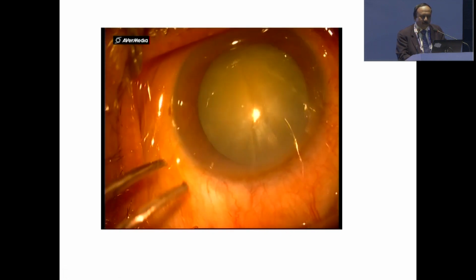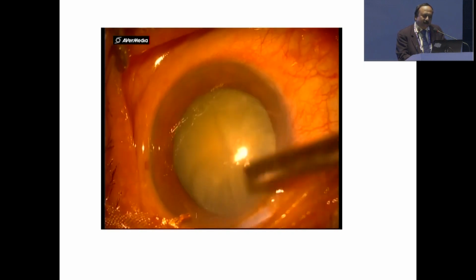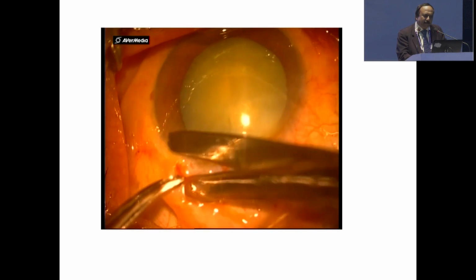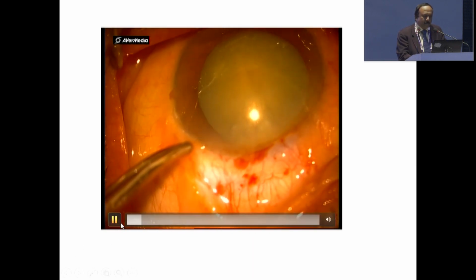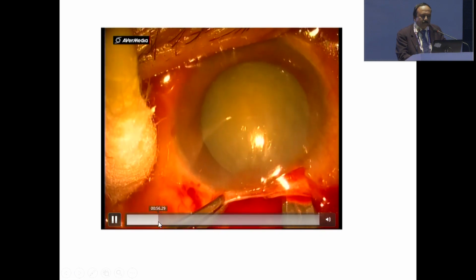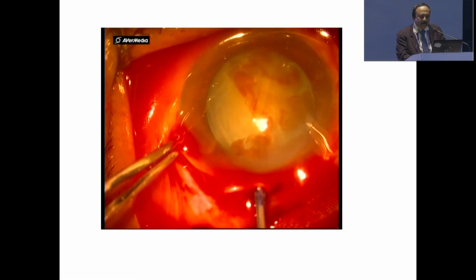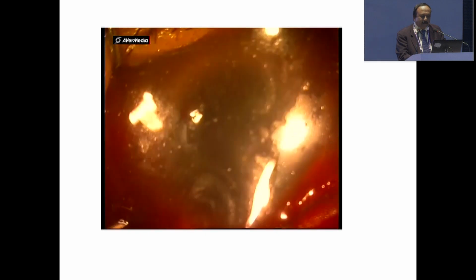So many times people cooperate as if they have been blocked. So you can start doing without any superior rectus suture. Then you will have a little bit of bleeding because you are not doing any cautery. That also helps in healing of the sclerocorneal wound.